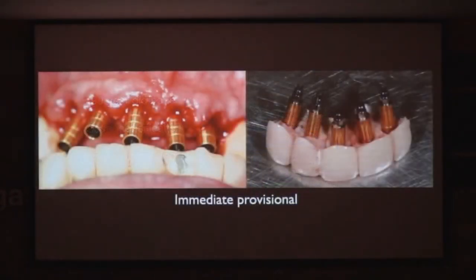So you can see, I just did that osteotomy pretty quickly, just like we did on the sawbones. He goes to his restorative doctor to get the provisional made, and this is just an analog. He's going to pick it up because we want to do it that day. Now, those look like crazy angles, and this is where I say you've got to believe in your plan, because I might not have put those implants where they look, but wait till you see the final outcome.